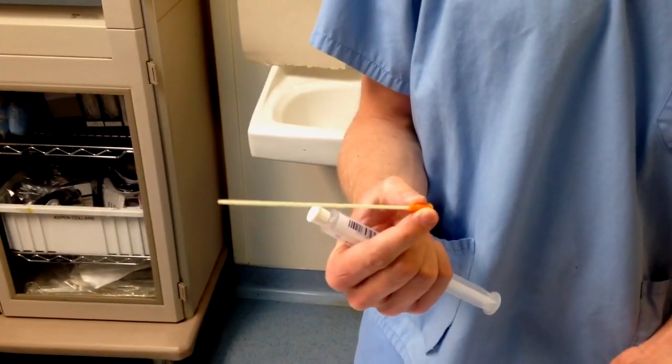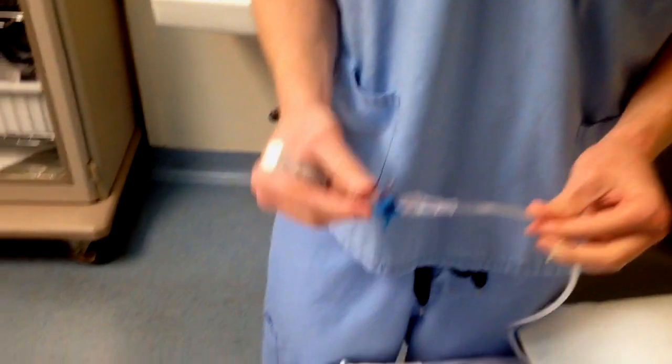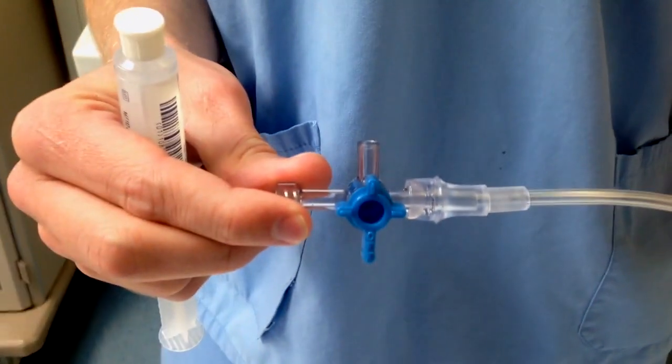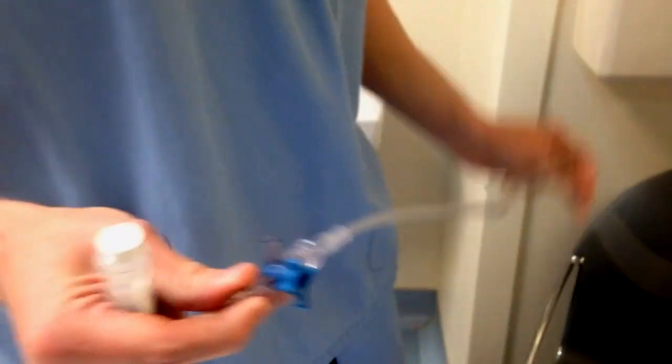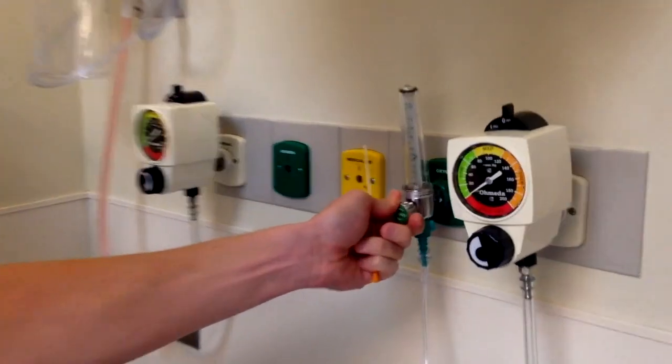I've got a long 14-gauge angiocatheter with no needle. I've got a three-way stopcock with all of the ports open, and I've got oxygen tubing hooked up to a wall oxygen source. I'm going to turn that on to 5 liters per minute.